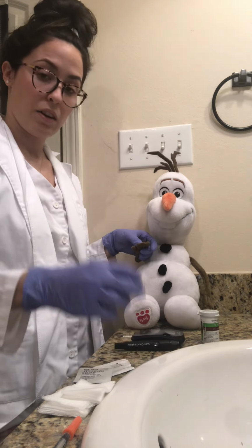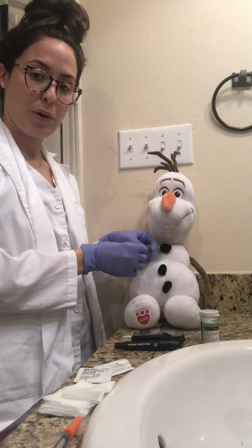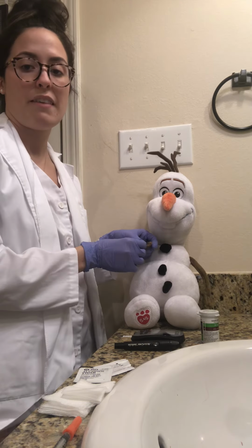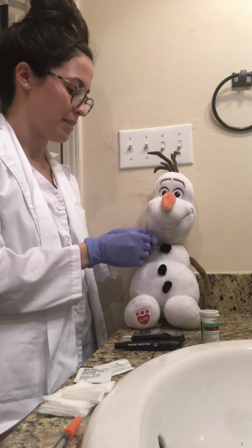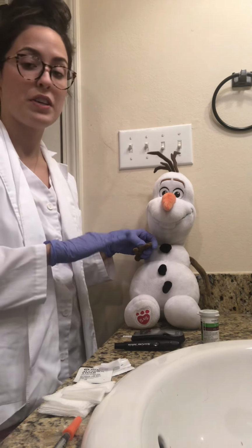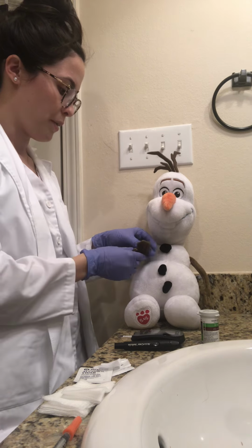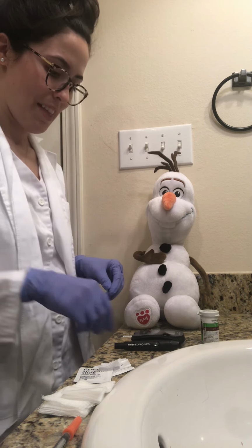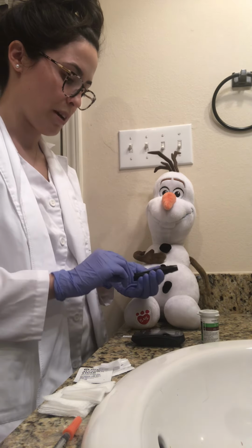We're going to get a little alcohol swab and just clean off the area real good. Make sure to have some friction whenever you're rubbing, just to rid the finger of any kind of bacteria that might still be on there after washing his hands. All right, and we're going to let this dry completely before we stick. And then I'm just going to get everything ready over here while we're waiting on that to dry. I'm going to load this up.